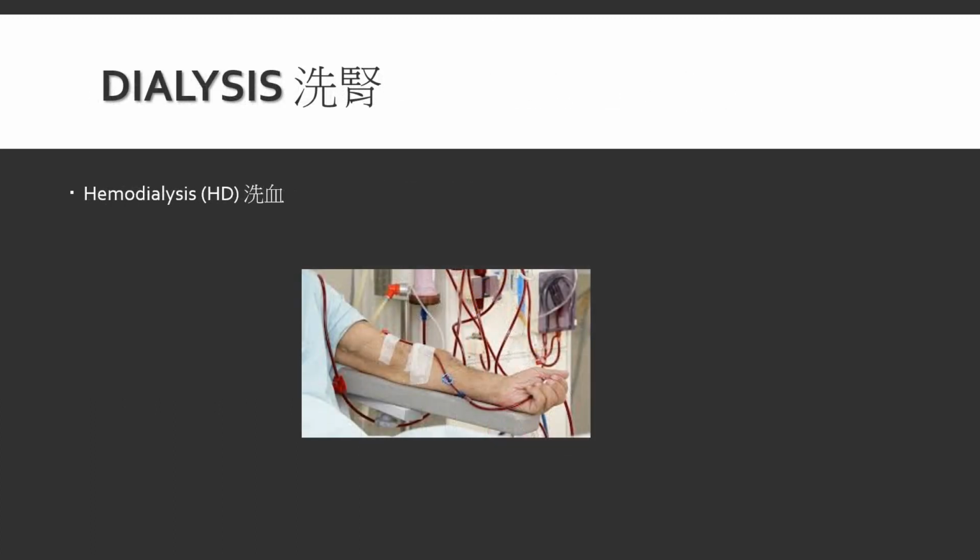When we digest food, our body creates many toxic substances that must be excreted. That is the job of the kidney. Kidney failure is now a very common problem. When the kidney fails, the patient can at most live for a few weeks because of all the toxins building up. Fortunately, we have dialysis technologies that can remove the toxins from the body.